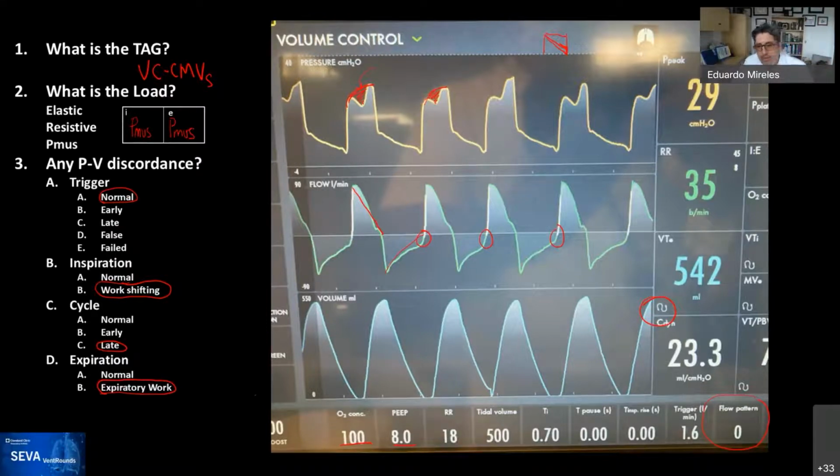Now, there is a question that came out, which is, why is the tidal volume higher? That comes from Satish Chandra. Rob, you just finished some work with Ping relating to the tube compensation algorithm on the servo, or the circuit compensation.